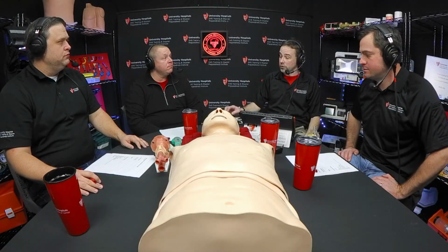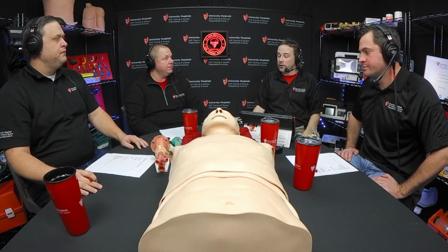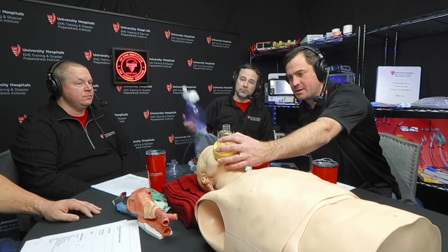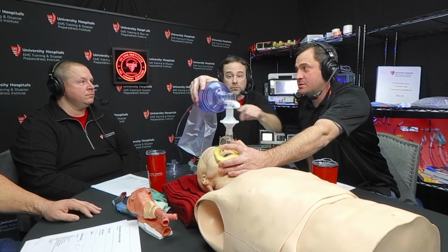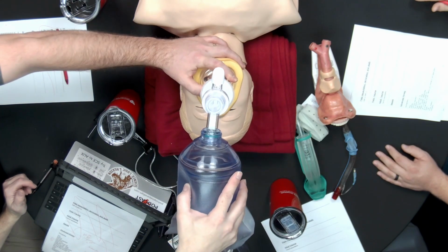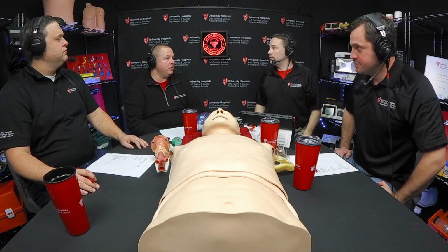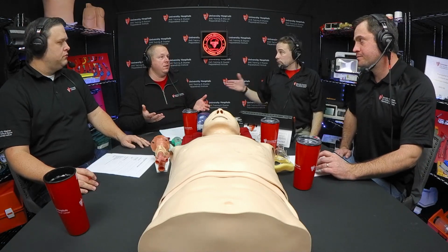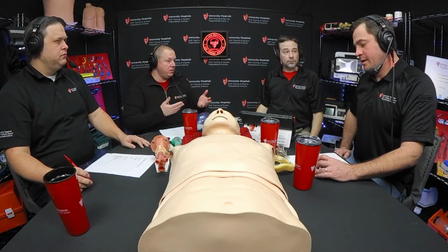If you're using a PEEP valve, somebody's got to basically hold the mask, that's the two-handed case. Or if you've transitioned from CPAP, you can leave the mask in place. It's already sealed, and go right to your BVM. And with PEEP, this works great because you're not breaking seals, if the head strap's still on there already, right? Then that's a great case. Or maybe switching to that is a good option in a low manpower situation, where I could open a circuit just because I need that mask portion of it because I only have so many providers. Sure. So that might be one of your tickets to switch.